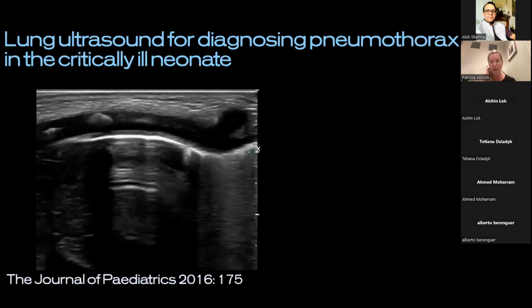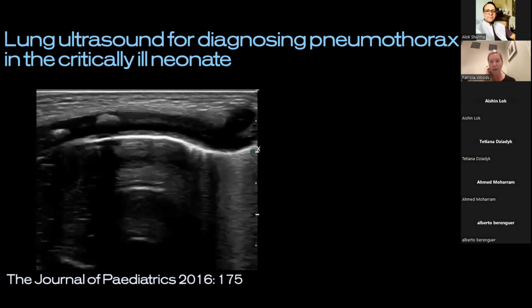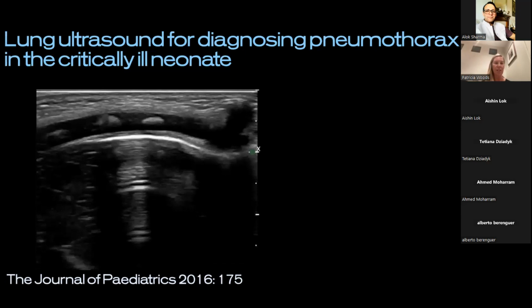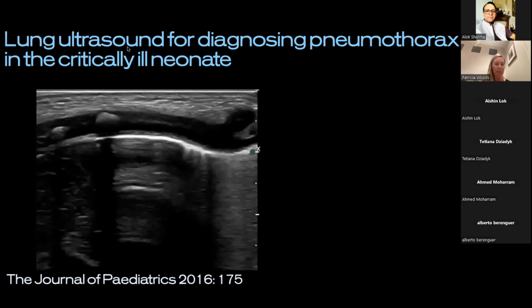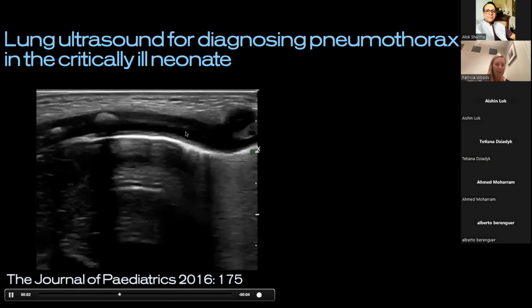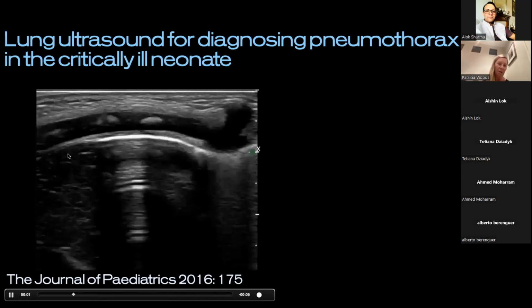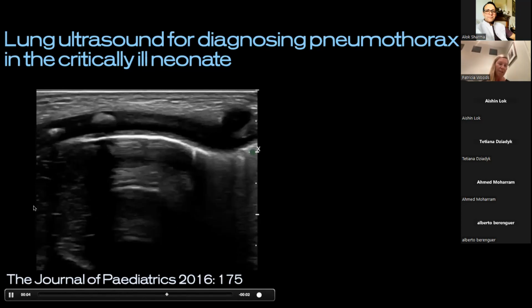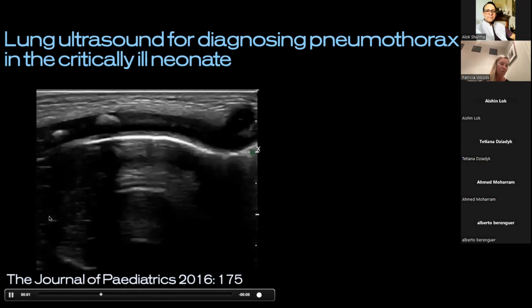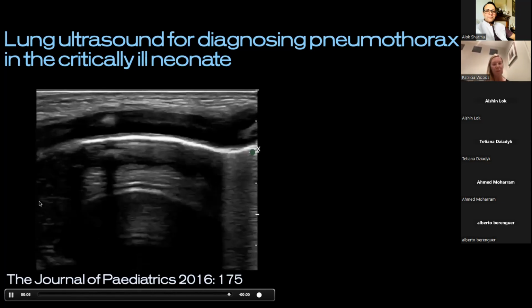So hopefully you'll recognize here that this is a midline longitudinal view. So the probe notches to the baby's head, and you can see some tissues here. You can see the sternum with the little ribs inside. And it highlights some beautiful things about ultrasound. You've got great definition of the thymus just here, that tissue and defined region that's sliding and moving away.